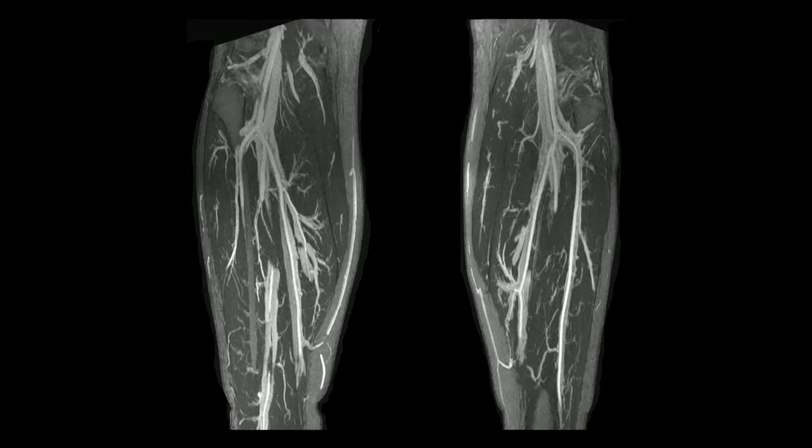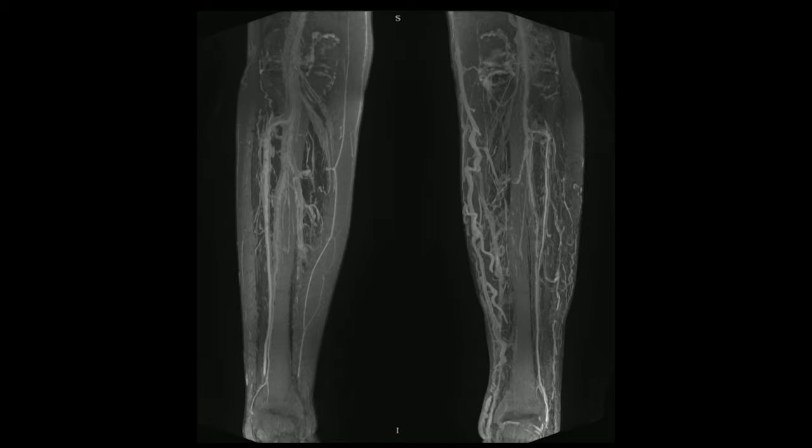As Professor Neeson has already described, the arteries and veins are well enhanced. In this patient, it was someone who had very proximal, fairly minimal disease, and so there's predominantly arterial opacification and arterial filling rather, and the veins don't show up quite as brightly. However, in our more diseased patients, a more representative example of what we get is something like this. There may be varicose veins, as shown in the left calf.